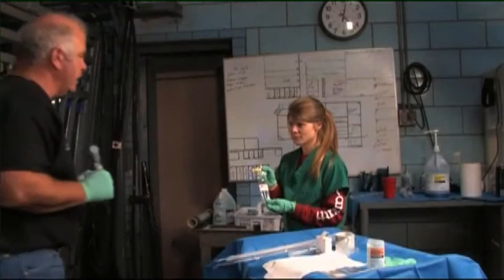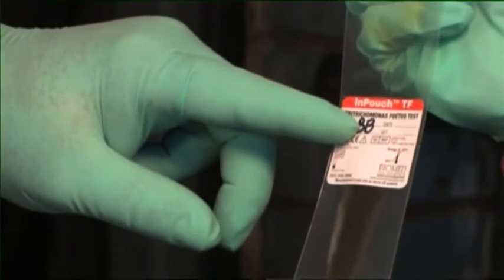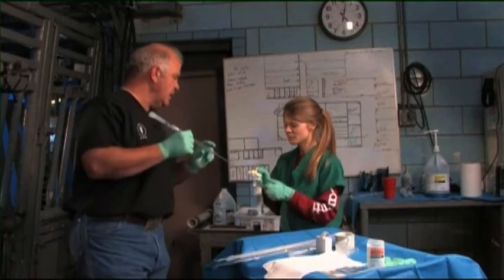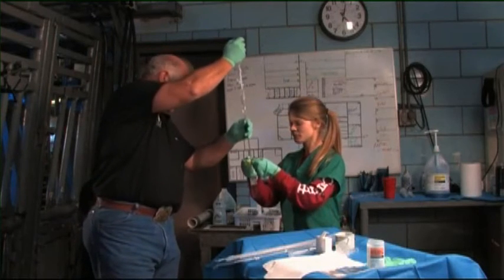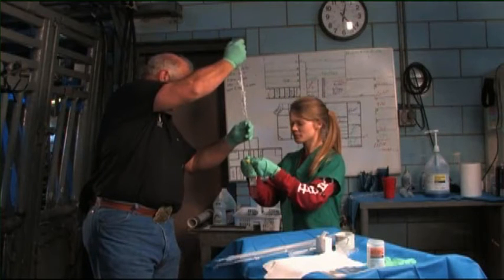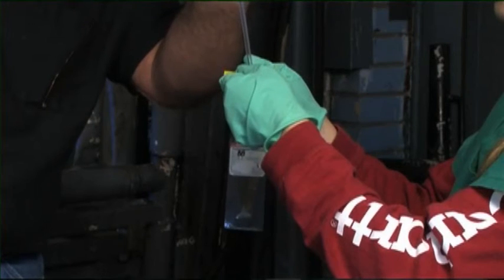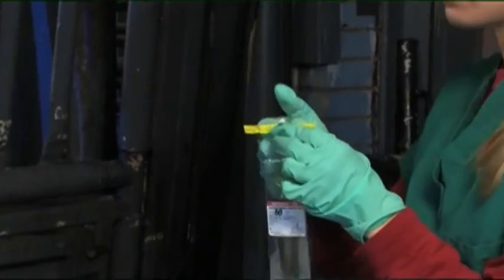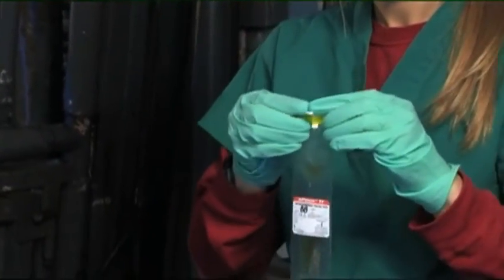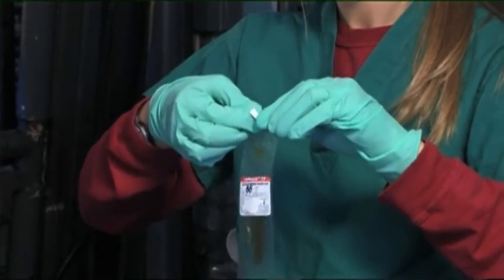As we prepare to inoculate our sample, we want to make sure that the bull's identification is properly recorded on the in-pouch culture media. We'll introduce the pipette into the upper compartment of the in-pouch, aspirating a couple or three times to completely inoculate the smegma sample into the pouch as the manufacturer directs. Then we'll make 3 to 4 turns of the top of the pouch to express the fluid into the lower compartment.